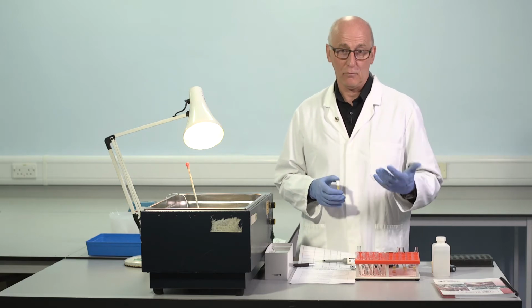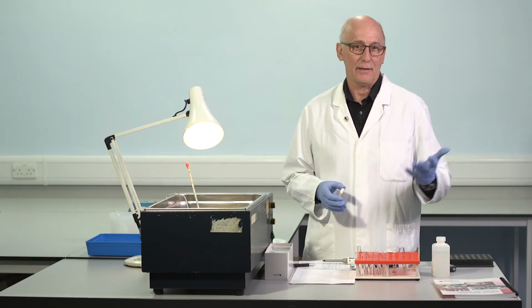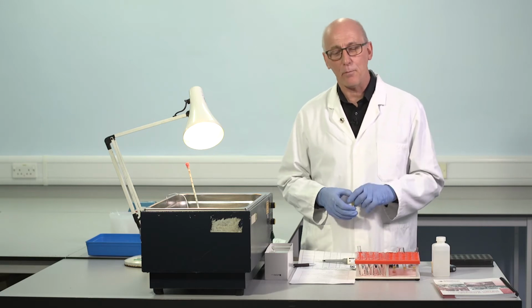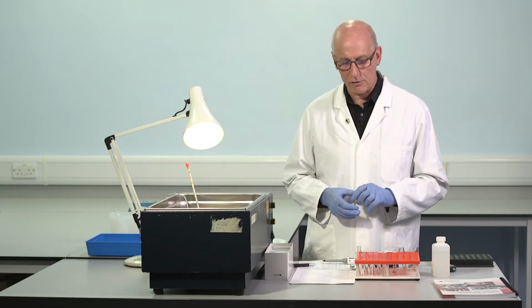Below this will be time to think about further infusions in a treatment situation, and of course below this increases the likelihood of von Willebrand's and haemophilia and so on. So we think that's an important level for a control in the 50 to 70 range.